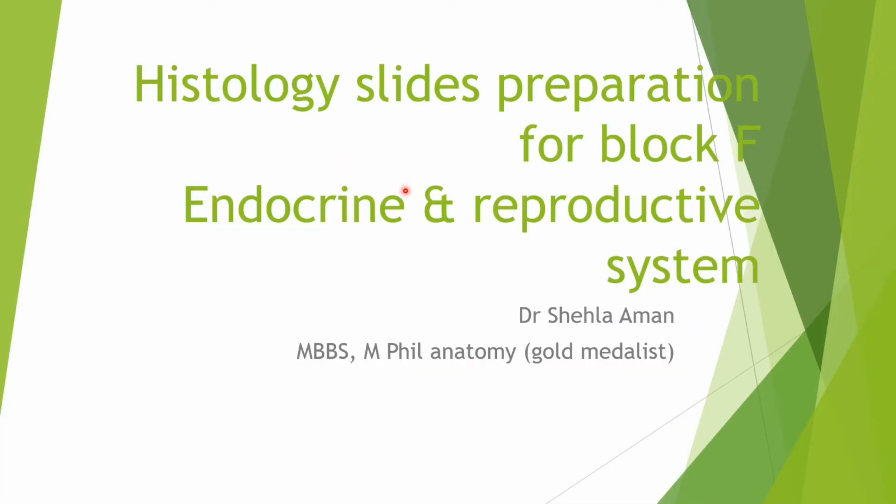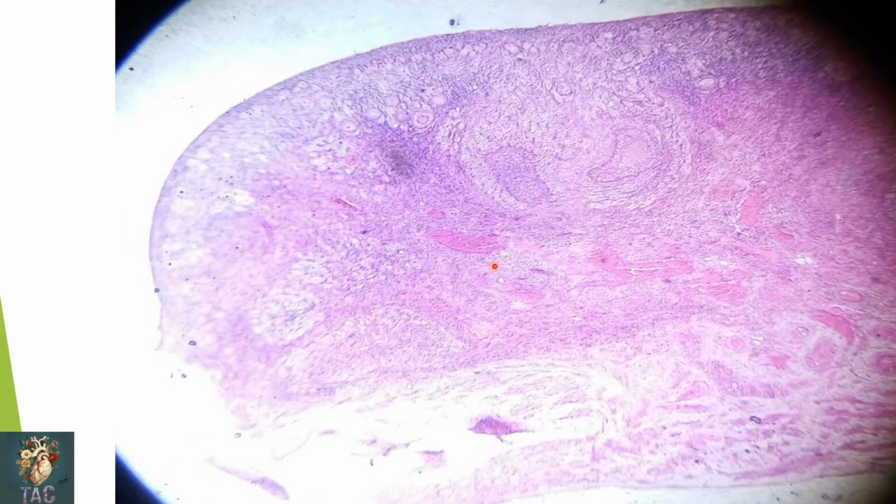In today's class we are going to do the slide preparation for Block F, that is the endocrine system and reproductive system. This is your first class, and inshallah in two parts we will complete the whole slide preparation class. So first of all, this is the first diagram.